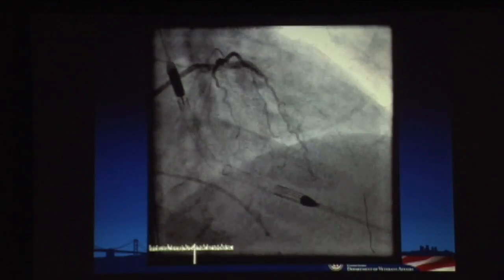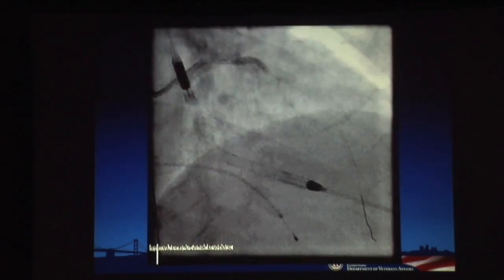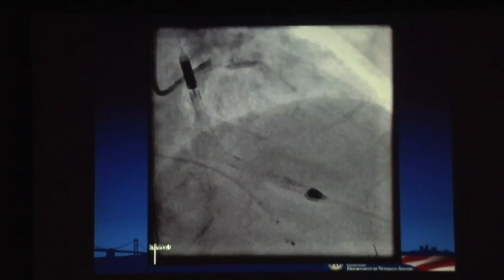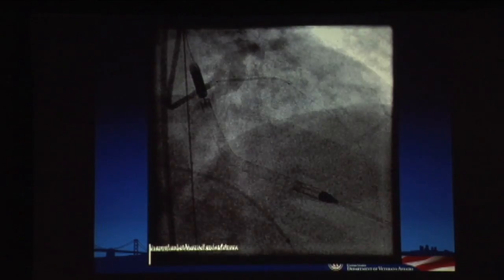This is the ballooning, and again, the thing you often see in these left main frail patients with the right occluded, you inflate in the left main, and often the pulsatility of their blood pressure goes away or diminishes significantly, but they maintain a good mean pressure because of the Impella. So it gives you quite a bit of comfort that you don't have to rush through these things. So these are the first inflations. That's the first picture after the balloon inflations.